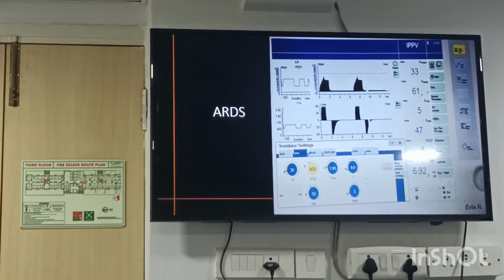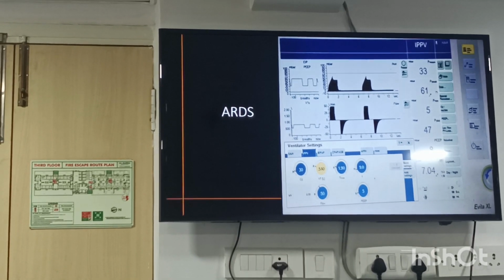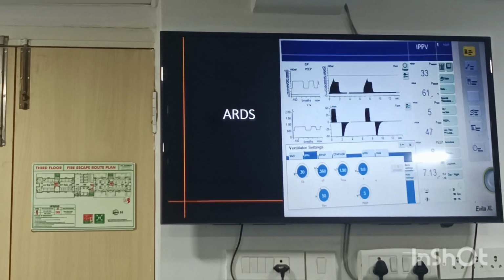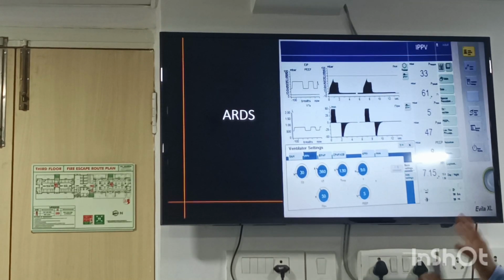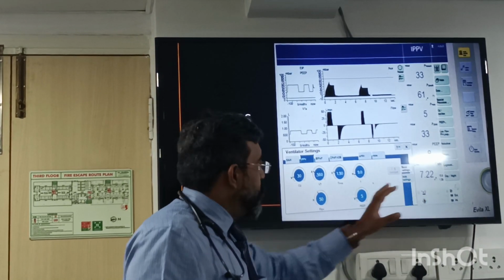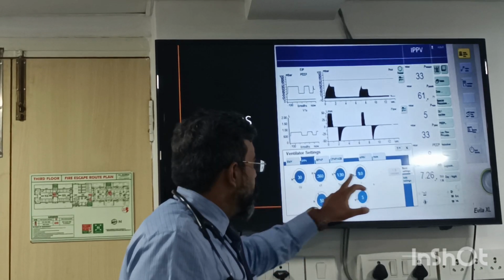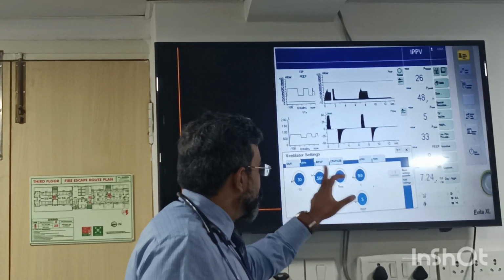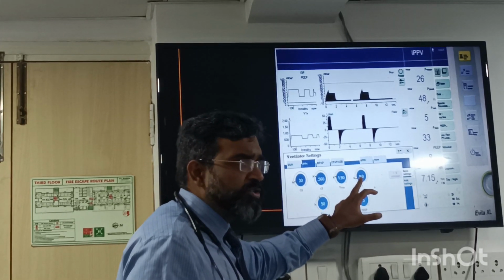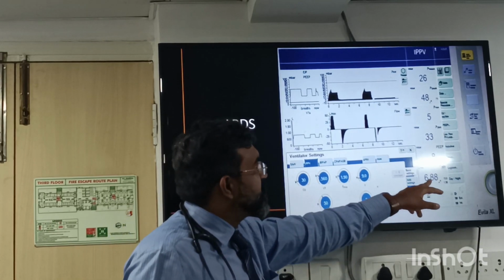So you come, no, let me reduce my tidal volume. The first thing that she does is she reduces the tidal volume, and she got it to 560. Now, what are you waiting for? You are waiting for this minute ventilation to settle down. So now at 560 and 9, my minute ventilation is going to settle down as a product of these two. 6 9s are 54, 5 9s are 45, 5 liters approx. It should come to 540 or something. So it has to settle down. Okay, it's settling down.